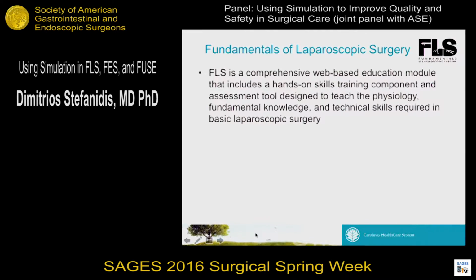Many of you may be familiar with this, but I'll go over them briefly if you're not. FLS is essentially a comprehensive web-based education module that also includes a hands-on skill training component and assessment tool, and it is designed to teach the skills required for basic laparoscopy.